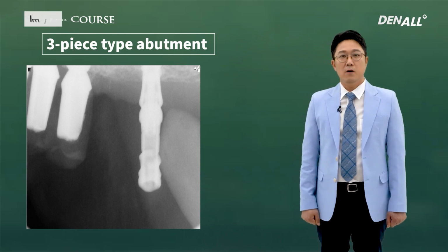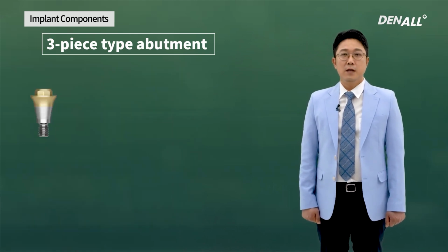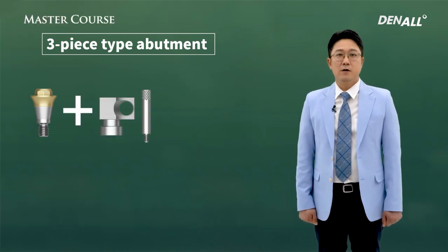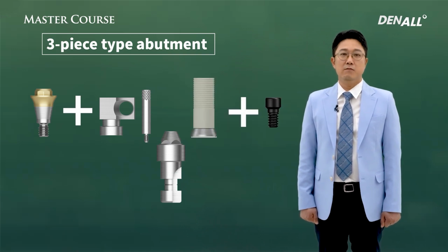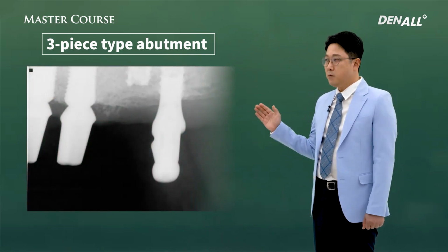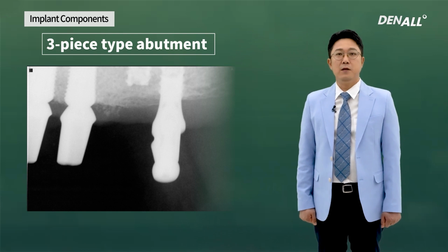And after a long consideration, I applied a three-piece abutment. First, the convertible abutment was connected, and I changed to external fixture structure, and I took impression using impression coping, and I used the analog which fit this structure and cast this abutment. In this image, convertible abutment was connected and impression coping was connected to check the adaptability on X-ray. On image, it looks very well adapted.